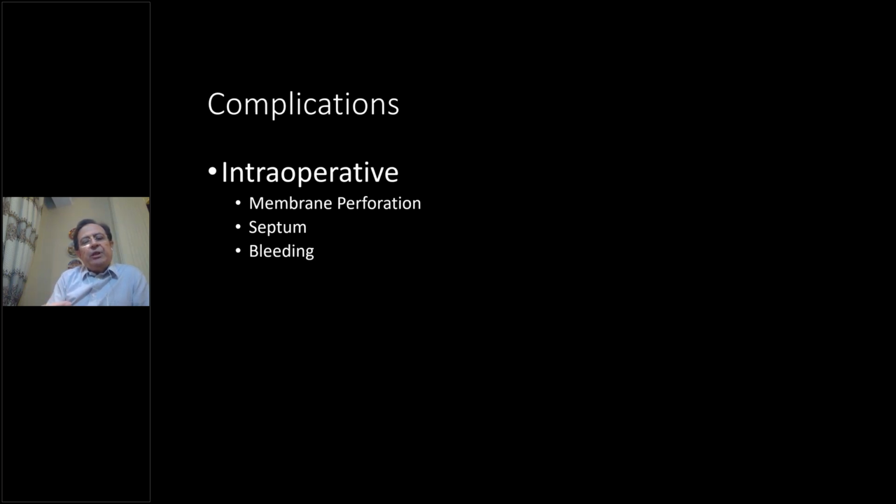But if the perforation is there, after the lifting, we need to put a collagen membrane or collagen plug under the membrane, or PRF.